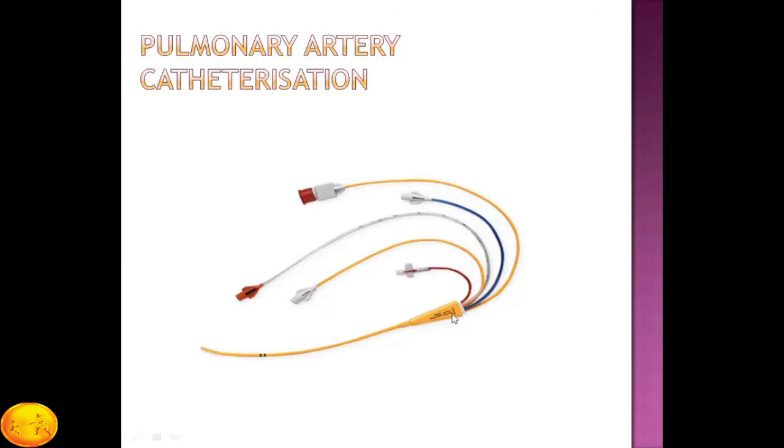As I told you in the earlier slides, there are cardiac index, stroke volume, preload and afterload. They all have some normal values. And if we connect to the continuous cardiac output monitor, we can assess all the values continuously and we can treat the patient.